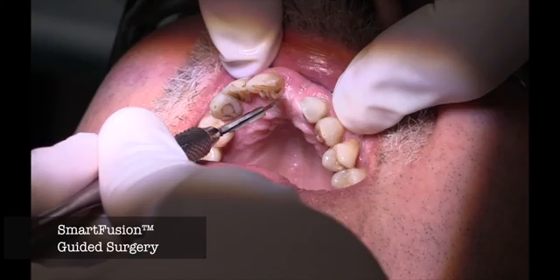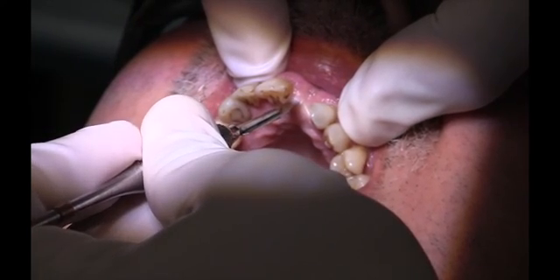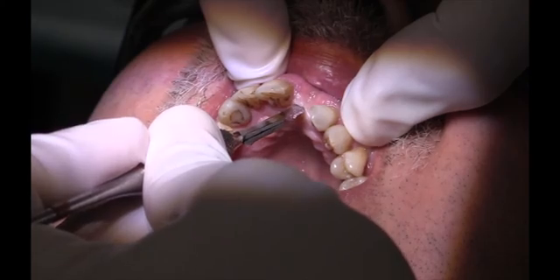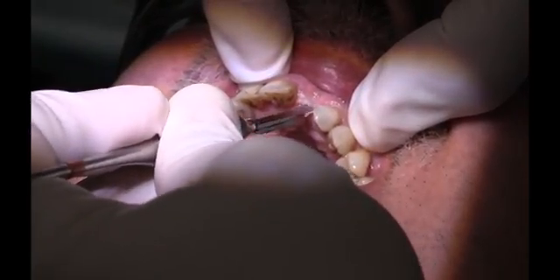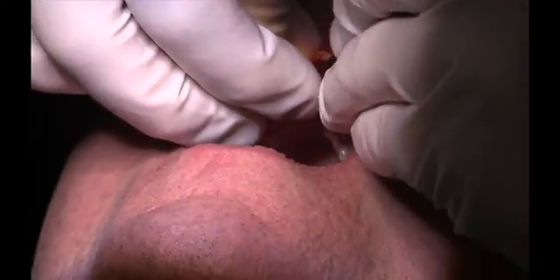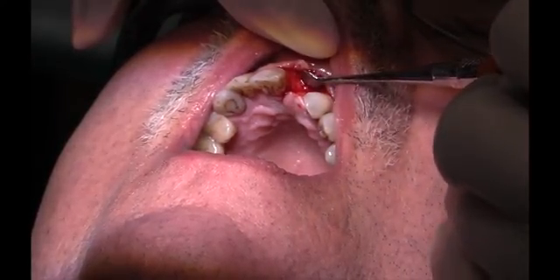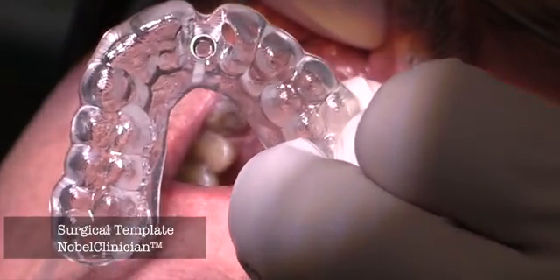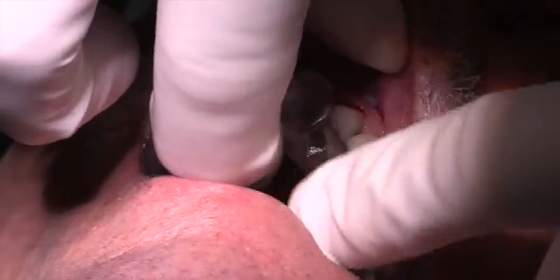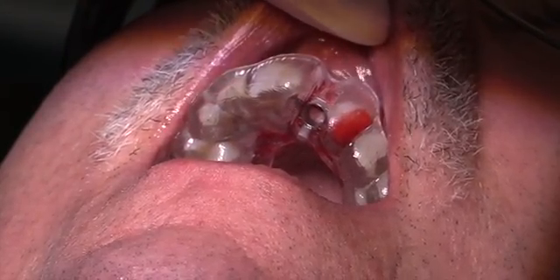The beauty of this technique is we're using a guided approach. I'll still flap the tissue because I want to preserve it and bring some of the lingual tissue out to the facial for an aesthetic outcome — we want to bulk the tissue out. So we may as well use the tissue where the implant osteotomy is going to be rather than just cut mid-crestal. With a minimal flap for guided surgery, I'll punch the lingual tissue a little bit. The template will guide every drill to the proper length so we can position this implant in the proper depth and angulation for ideal surgery.